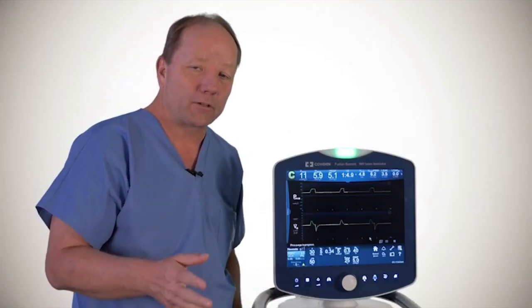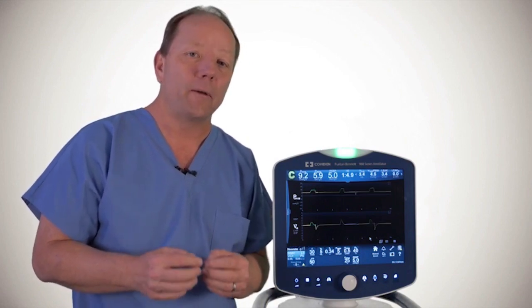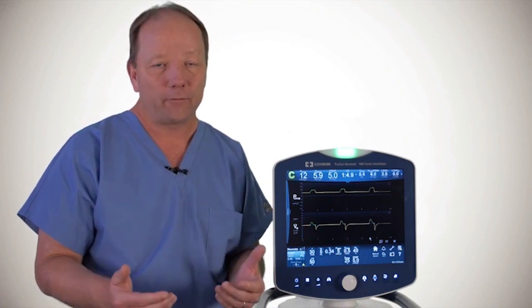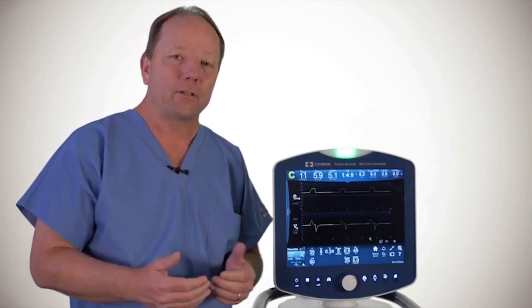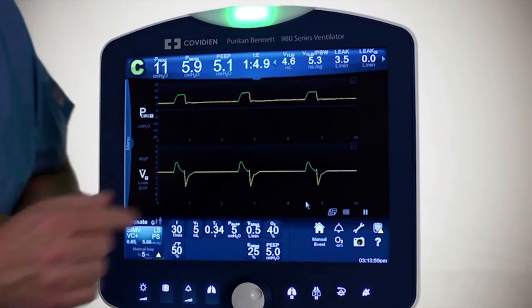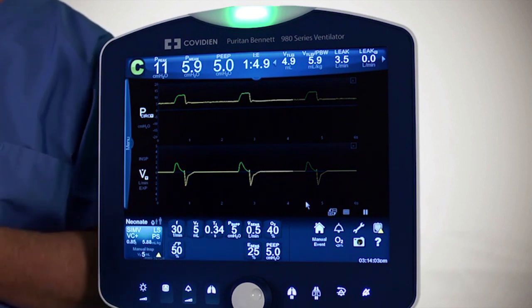Here is something unique about the ProxFlow sensor: the internal flow sensors are always still working in the background, and you as a clinician can decide how much information you want to view. In this scenario, I have Leak displayed here, and there is no Y after that leak, meaning the internal flow sensors are detecting a leak somewhere in the circuit.